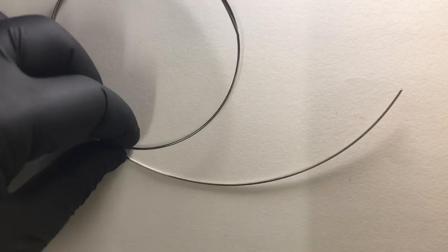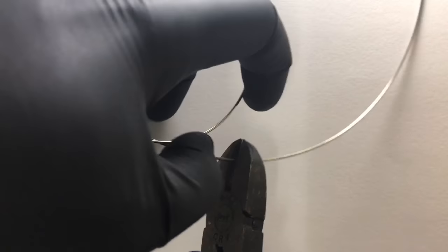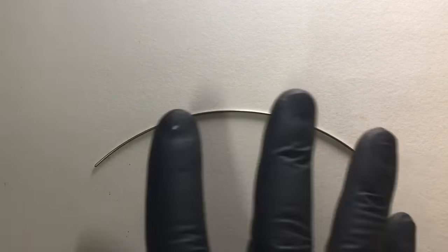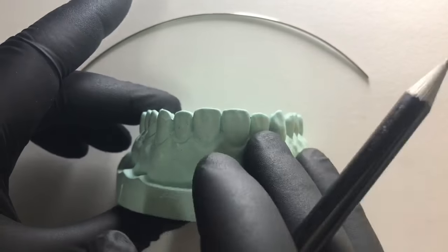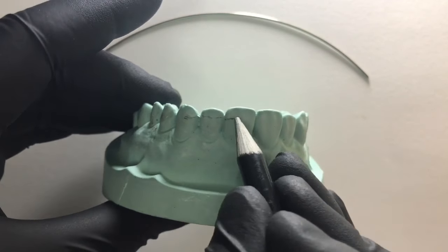First we need to take a desired length of wire. Roughly for a short labial bow, 10 centimeters of wire is enough. We need to cut that desired length. As you know, a short labial bow extends from canine to canine in one arch, so we need to do some markings on the cast where our bow would be resting and where our U-loops would be resting.